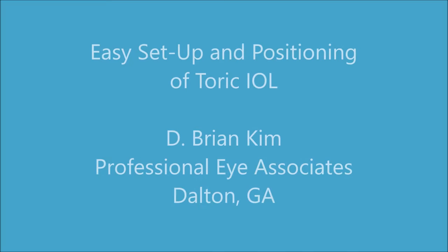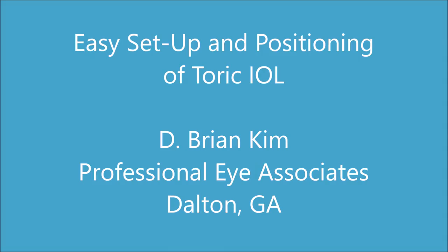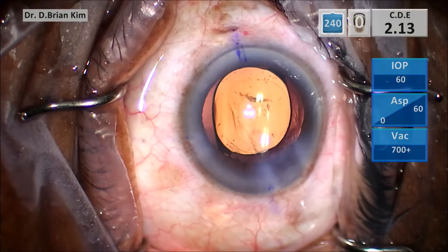Hi, this is Brian Kim. I'd like to share my approach to the easy setup and positioning of a toric intraocular lens. First, in the preoperative area, I like to have the patient sitting upright, and I use a toric marking instrument to mark the three, six, and nine o'clock positions, as you can see here.